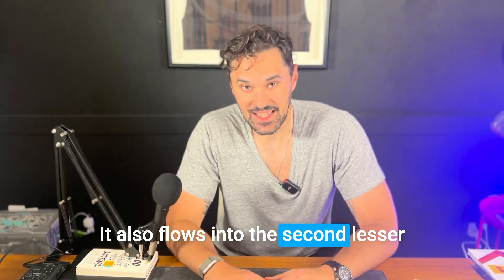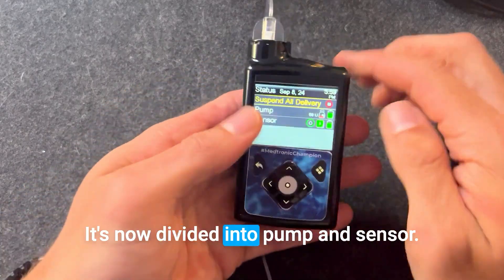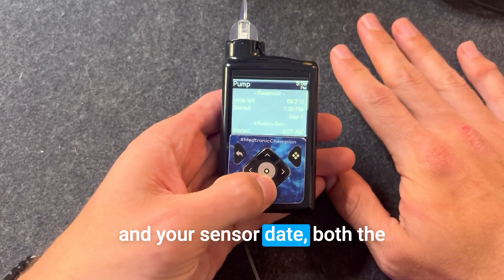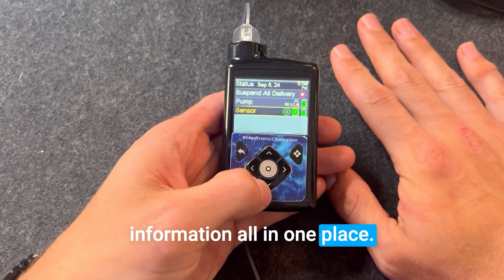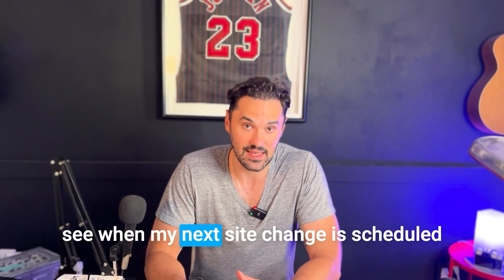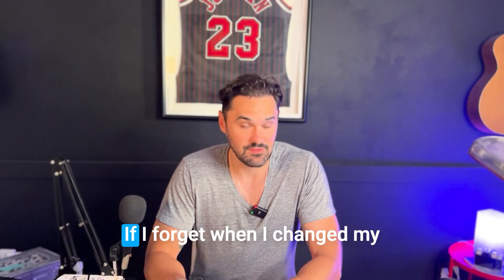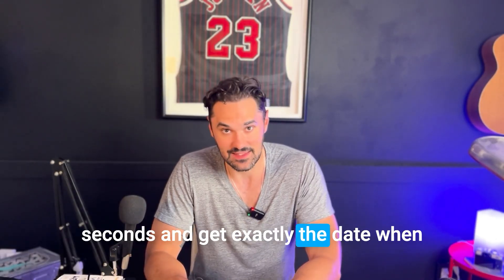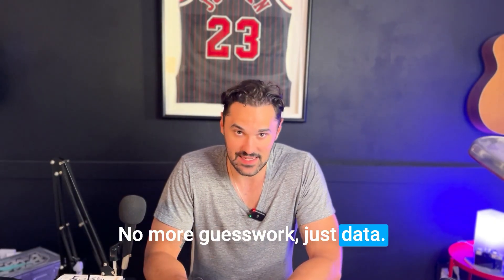That flows into the second lesser known feature I really like, which is the status screen upgrade. The status screen leveled up — it's now divided into pump and sensor. It tracks your last infusion set date and your sensor date, plus battery for both the pump and the sensor, all in one place. This is great from a travel standpoint because I can see when my next site change and sensor change are scheduled, so there's no guesswork. I can check the screen in seconds and get the exact dates.